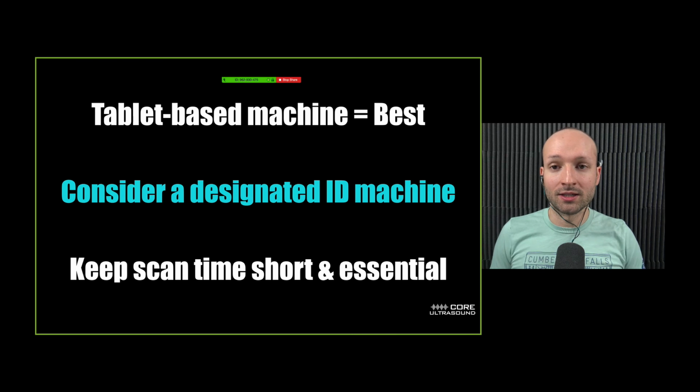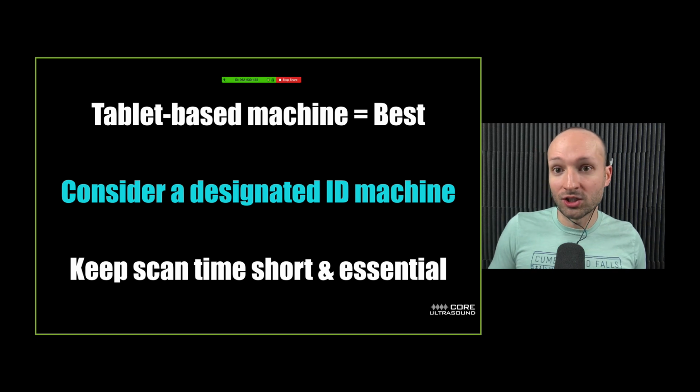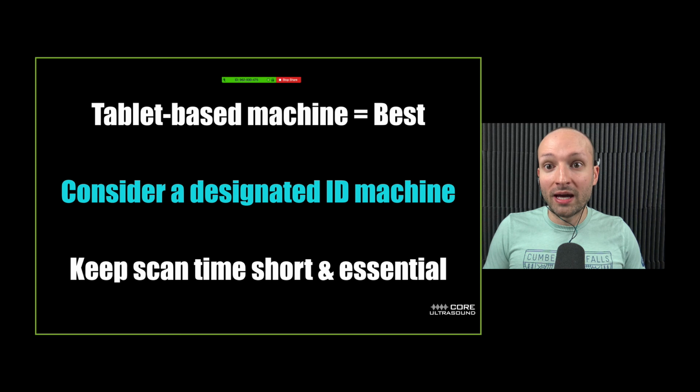What that means is if you're an intern, you're doing your ultrasound month, don't go in there and scan a known COVID patient. Right? If they're known COVID, they've already had an ultrasound, don't go back in there and do it. And that's just to minimize risk to the machine, to you, and to other patients. Keep it short, keep it essential, and try to do everything at one time.